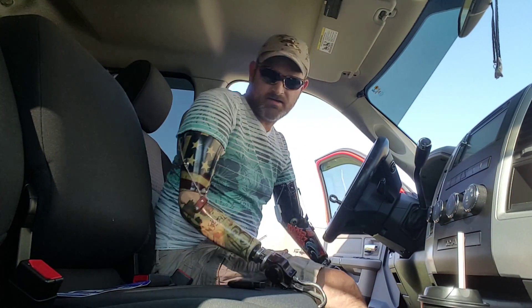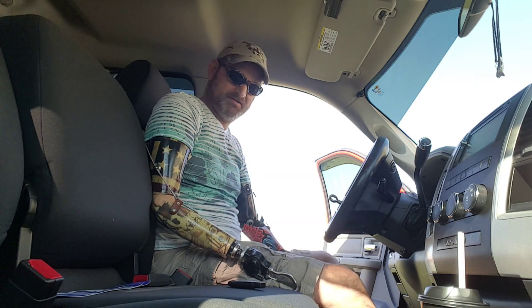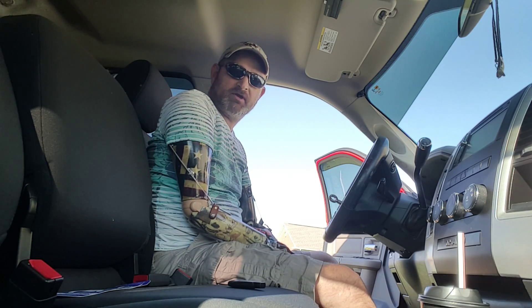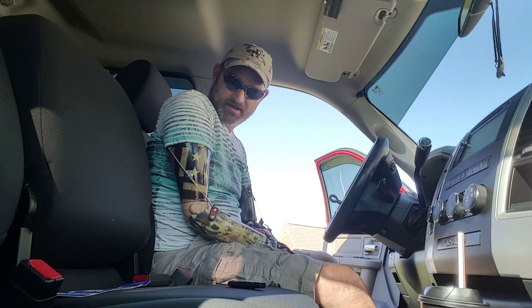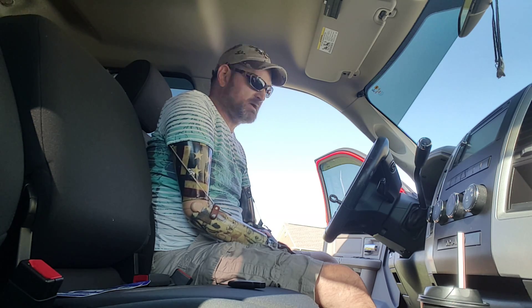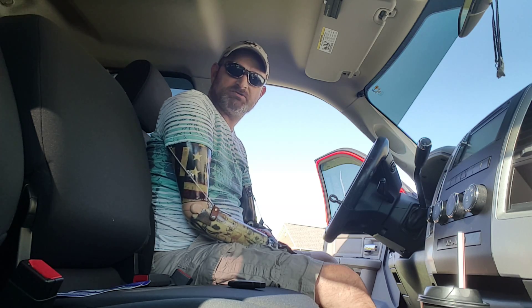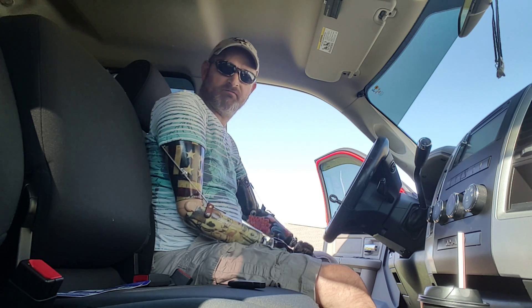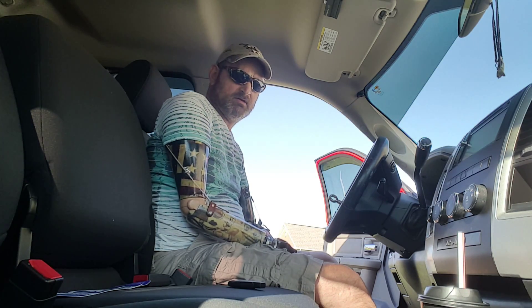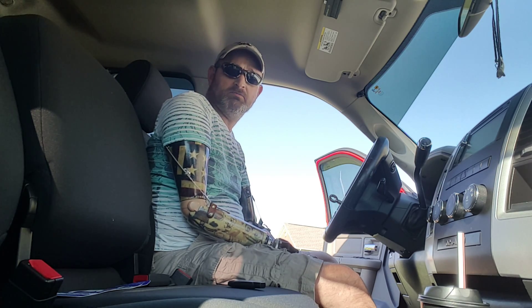Hi everyone, it's Billy P — the bilateral amputee. I love saying that, it's awesome. Anyway, I'm about to leave to get a haircut and I want to show you how I put a seatbelt on. I've got three different ways of doing it. The first way I'm going to show you is how I did it for the first three years after losing my arms — I only wore a left arm, every single day, and did everything that way.